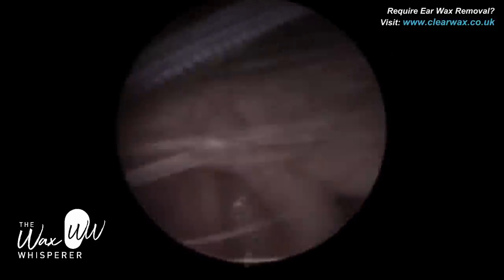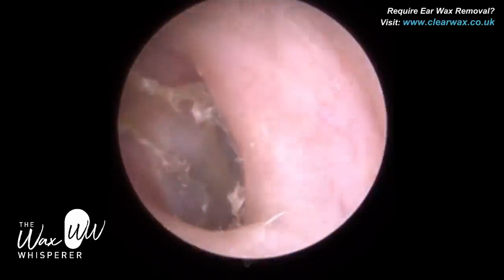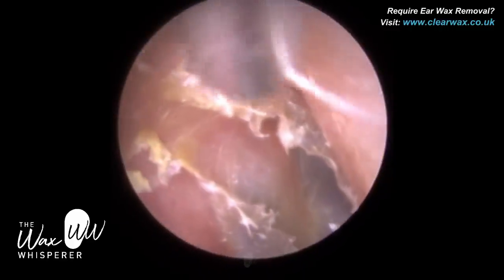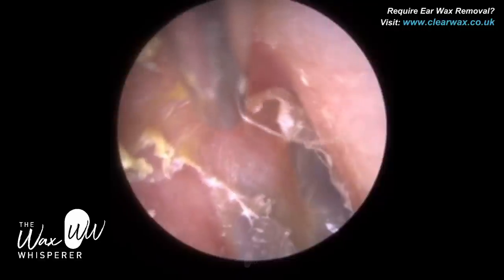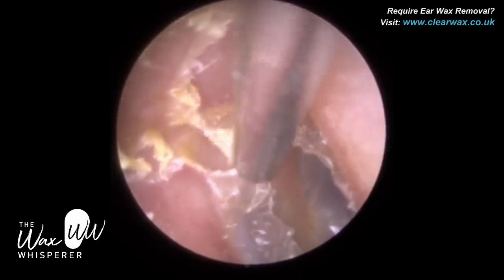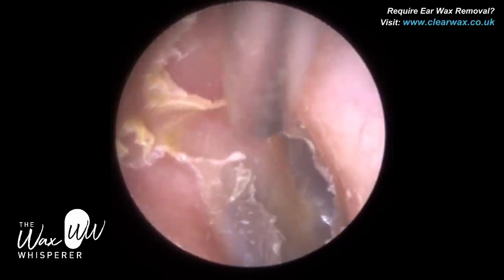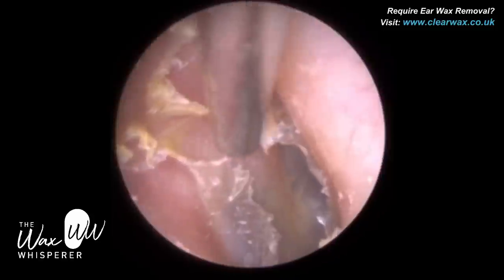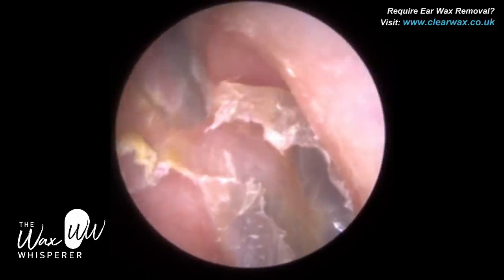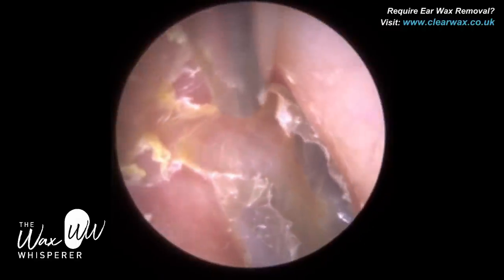About half a centimeter away from the eardrum, the ear canal narrows and then protrudes back outwards. Unfortunately for this patient, this skin, as it's shedding and migrating outwards like a conveyor belt, is getting trapped at this narrowing — the isthmus — and it's no longer migrating, so the skin is building up. This is a very early onset of someone who may later, if they didn't receive treatment, develop keratosis obturans.